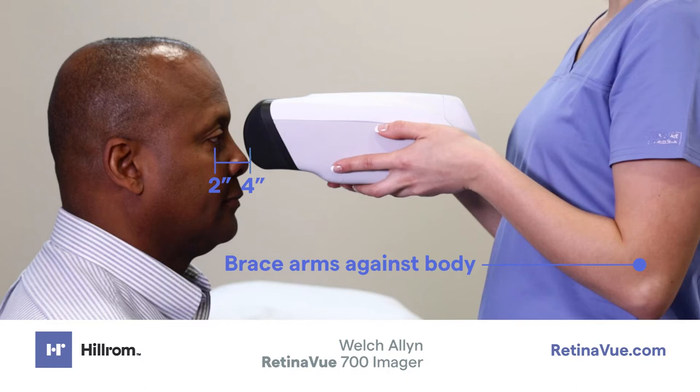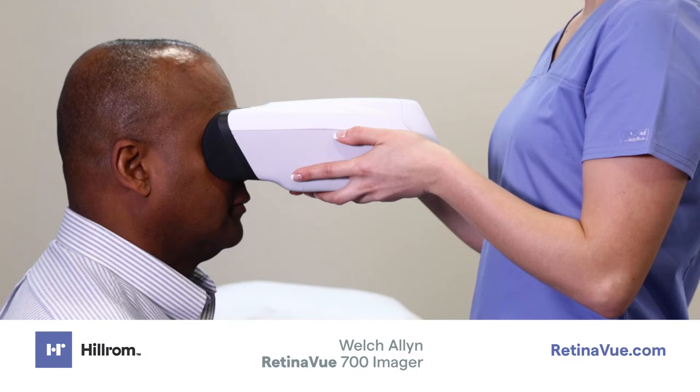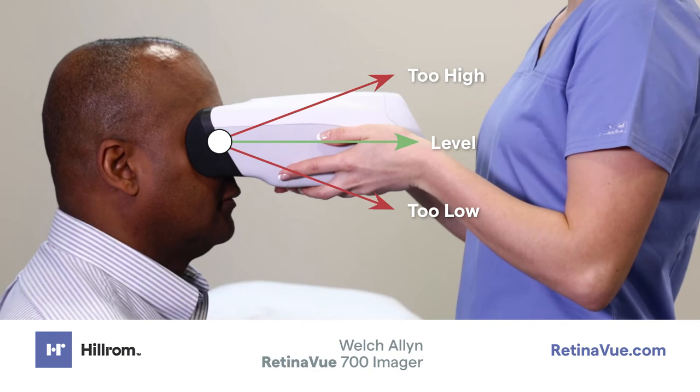Once you are in a comfortable, stable position, move your body toward the patient to place the face cup securely on the patient's face. It is important to keep the imager straight and level in front of the patient's face. Do not tilt the imager up or down.